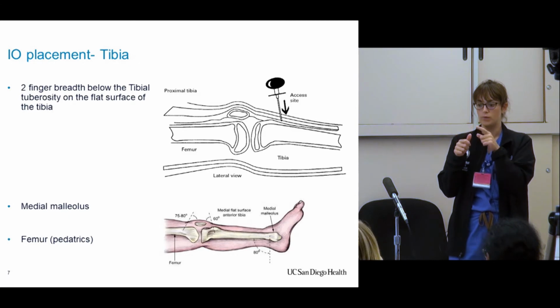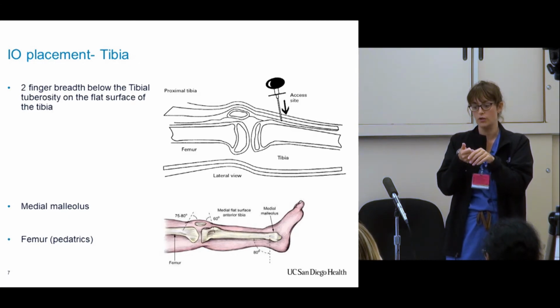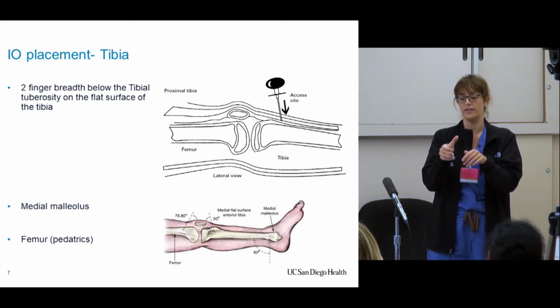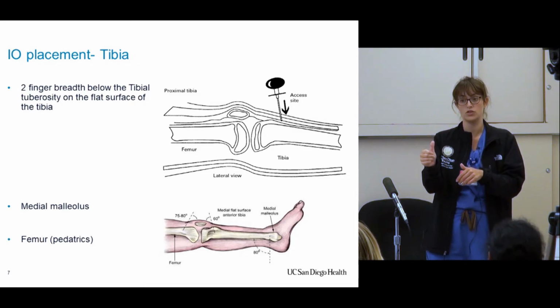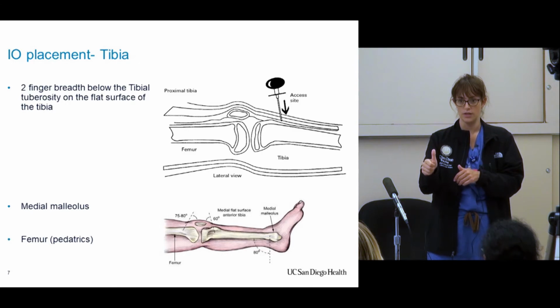Then you pick your location, you adjust your angle, prep your skin. You go into the skin, you bump the bone, you know you're there, and then it's just like if you've ever used a drill or actually fired a gun, it's the same concept. It just has a trigger and consistent pressure, and you're going to feel it give way. And when it gives way, that means you're in.